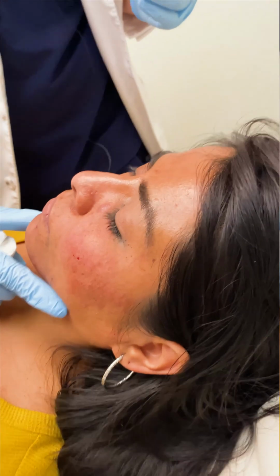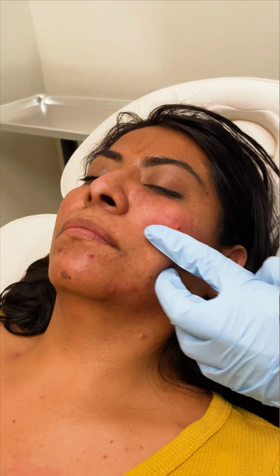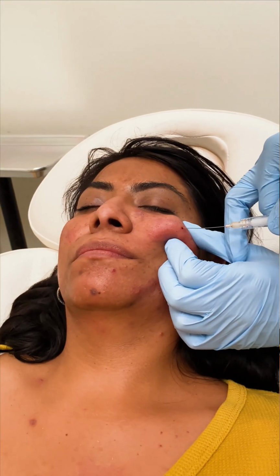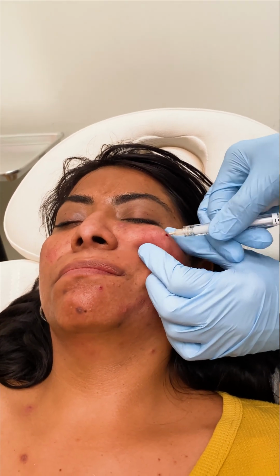And if you look at one side compared to the other side, you can see how there's a little bit more projection now. It's really helped out our cheekbones. And we're not quite done yet. We're going to do a few other things, basically also going to try to get a little bit more shape here in this mid-cheek area. And then we're going to place a little bit more deep to the bone with Radiesse, which is a calcium-based filler, also stimulates collagen. And that's how I can blend it all really nicely.